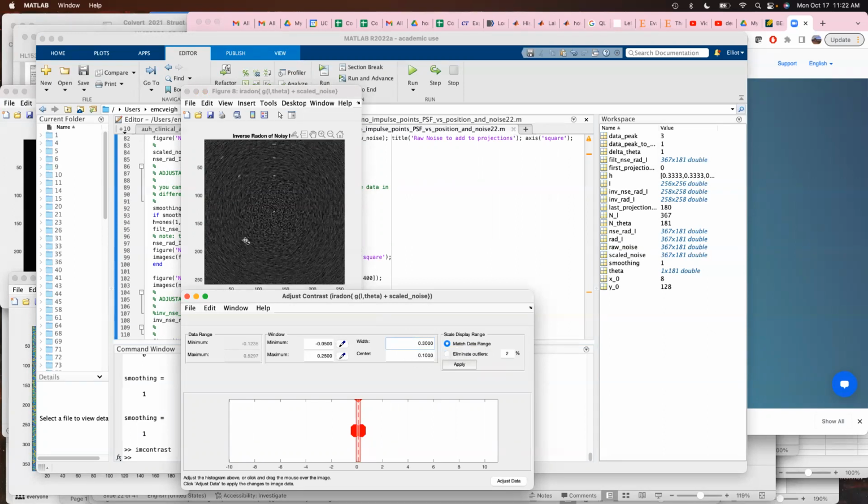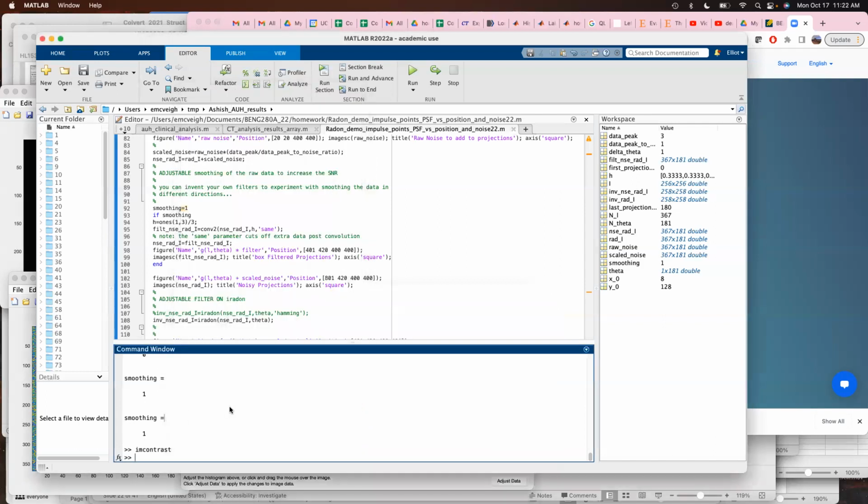Interesting, filtering in that orthogonal direction had a completely different effect on our resulting image, in the sense that we start getting these correlations in this direction as we move away from the center. So filtering in the raw data space is worth understanding.